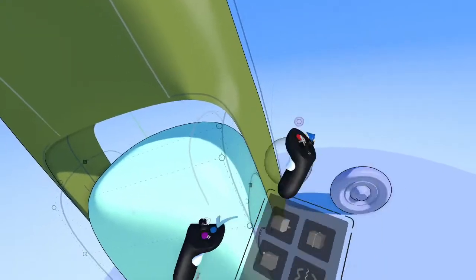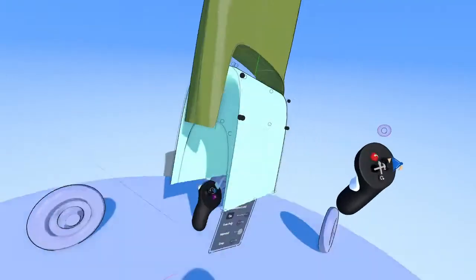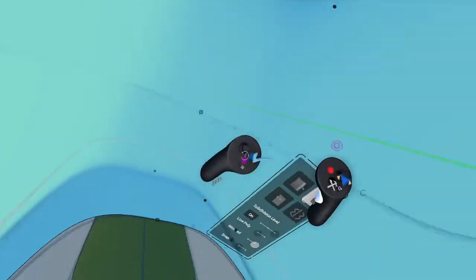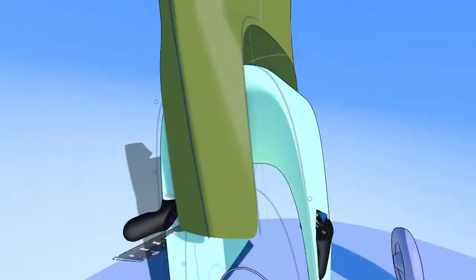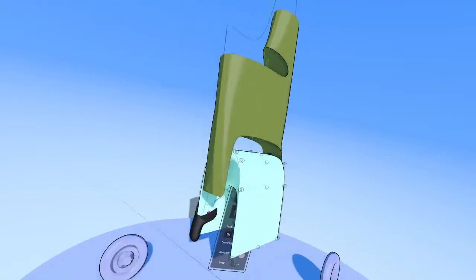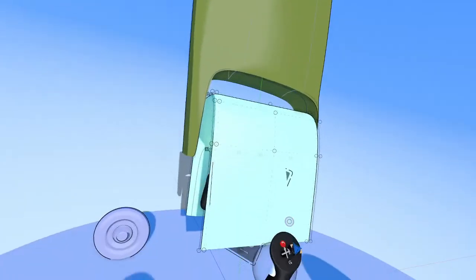All right, now that we have the general shape, we can click in some edge loops here for tighter radius. Yeah, looks good. And we can turn on auto select loops and then drag this entire section here in the middle to the other side and connect it together, just like that. And drop in some new edge loops to tighten things up. You can see I'm not matching this line that well, but that's because I like how smooth that inner form is. So I think I'm going to leave it like that.